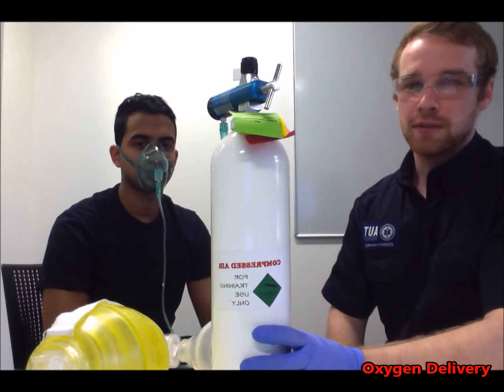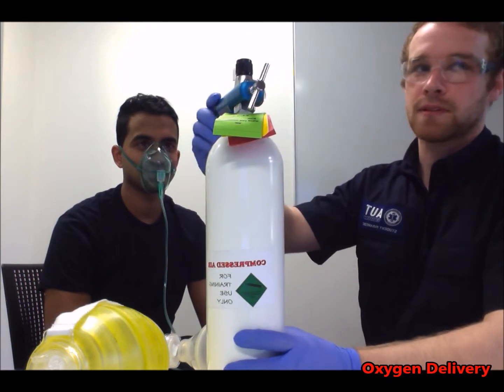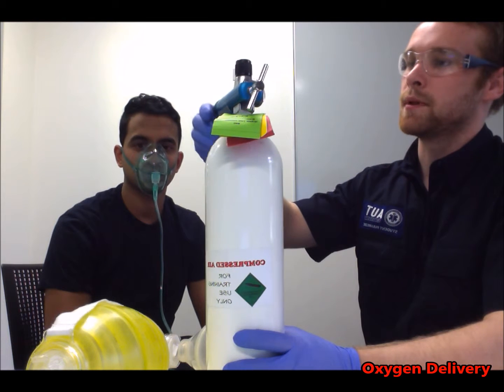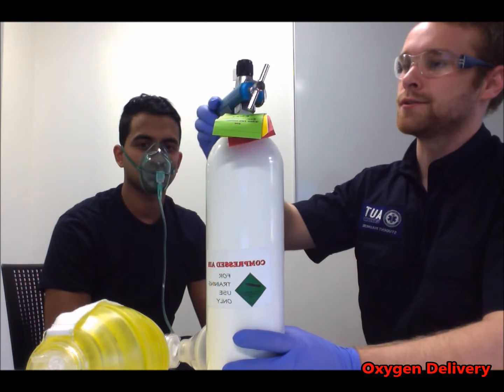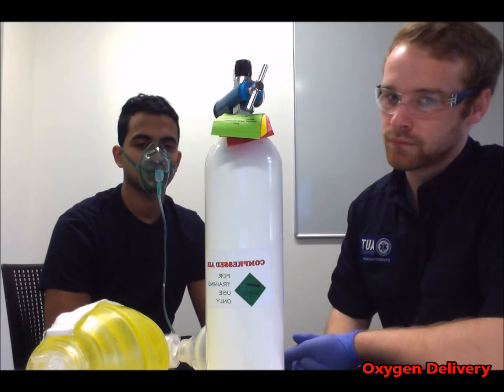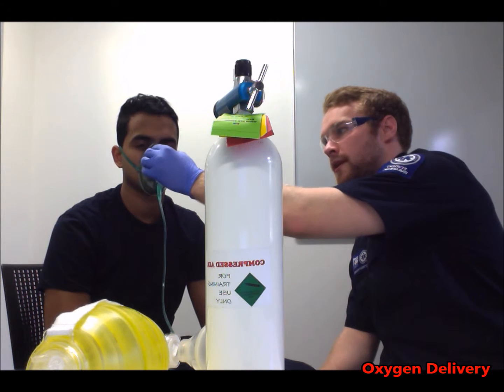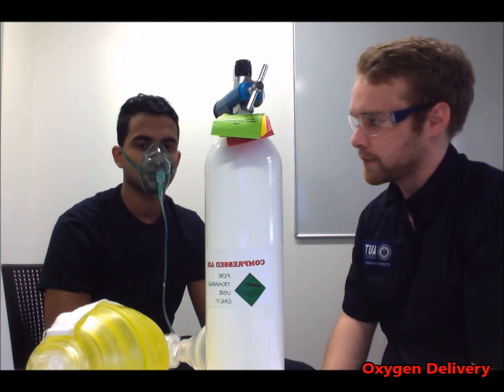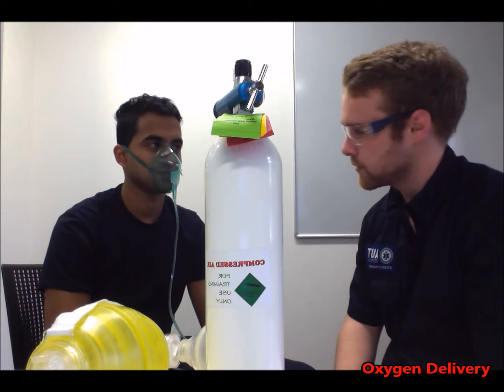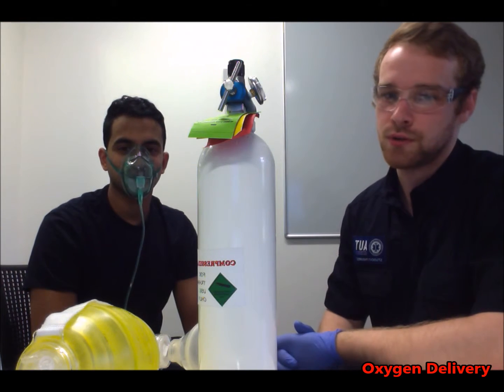Next we're going to turn on the oxygen. And I'm going to turn this to 6 or 8 litres per minute, just to deliver the oxygen. So it's on 6 litres. So ensuring it has a nice tight seal, we can tighten the seal by bending it over the nose. But apart from that, Dave, are you receiving oxygen? Yes.